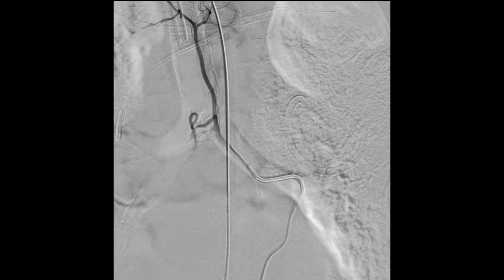So that's what we did, and this is our post-treatment angiogram, and we can see that no more blood flow to this area of abnormality, but again, no coils to block us in case we need to go back if they develop new capillary networks going that way.